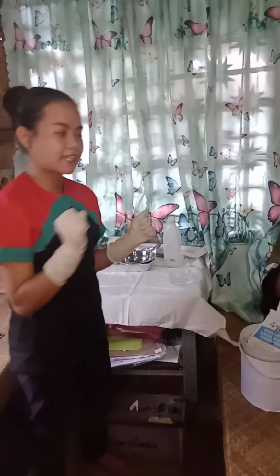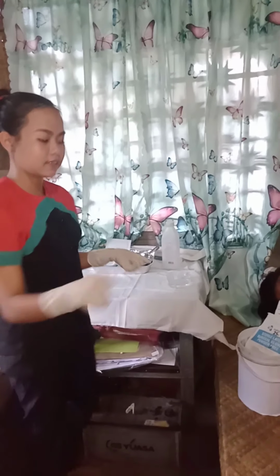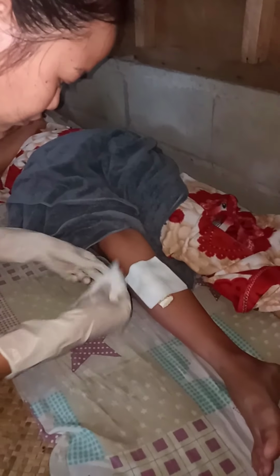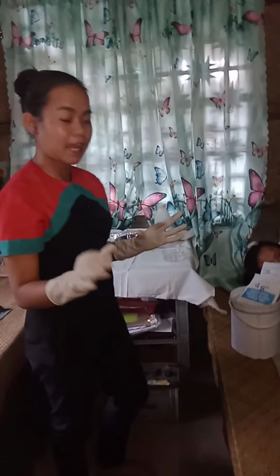Then after that, it is the time to apply dry 4x4 gauze over the wet gauze. Then apply this thick woven pad. Then lastly, it is the time to tape it.